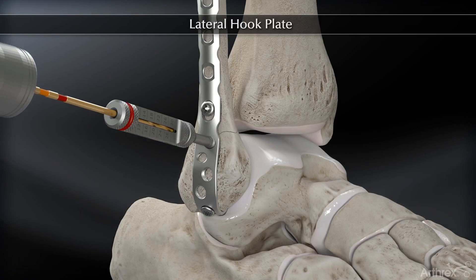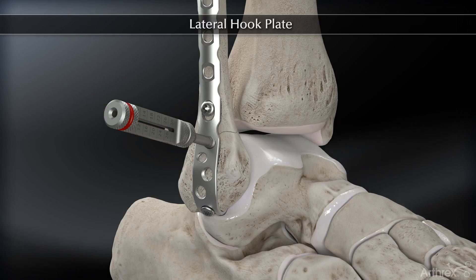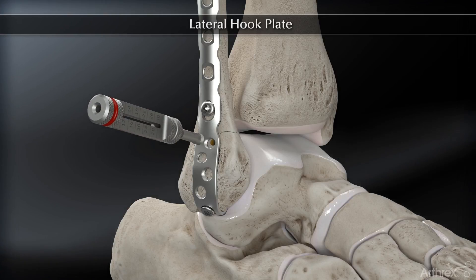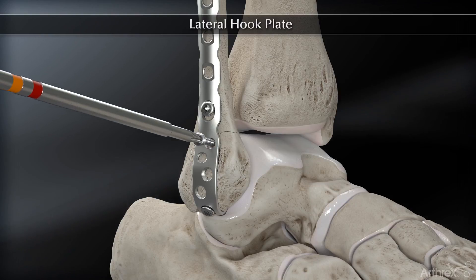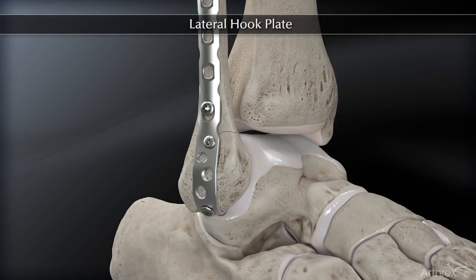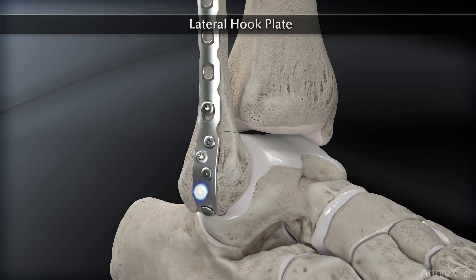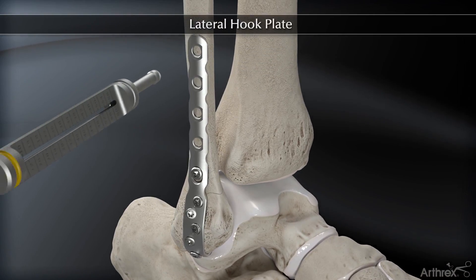The surgeon has the option of placing distal screws as necessary. These are either 2.7 millimeter locking screws or 3.0 millimeter cancellous screws. The drill guide, drill bit, and screwdriver are color-coded for this step. In this case, all four screws are being filled with locking screws, but this is not a necessary step.